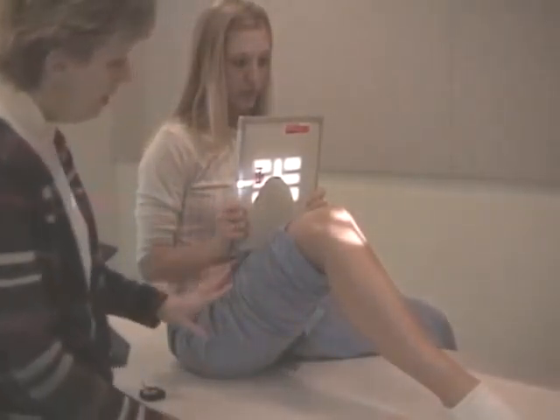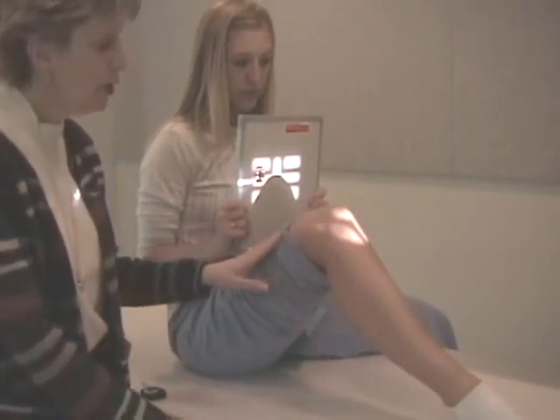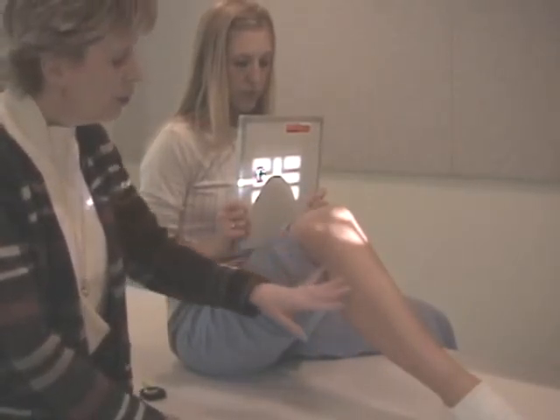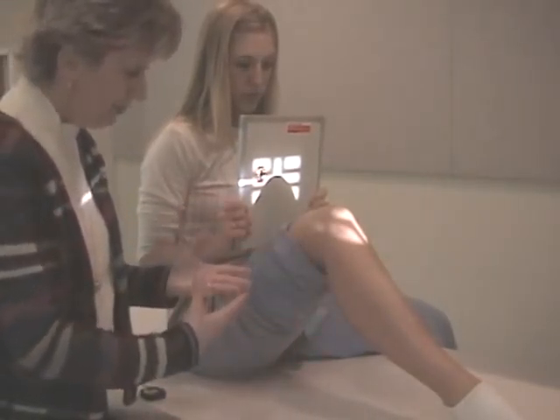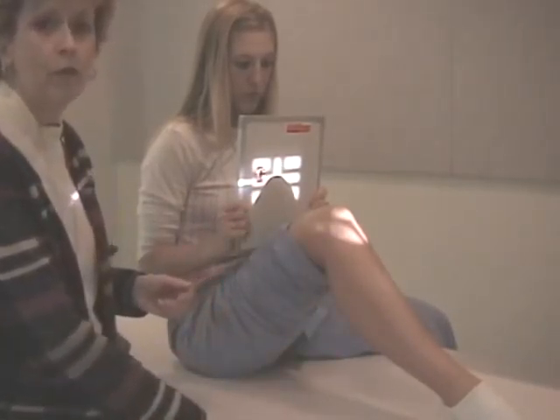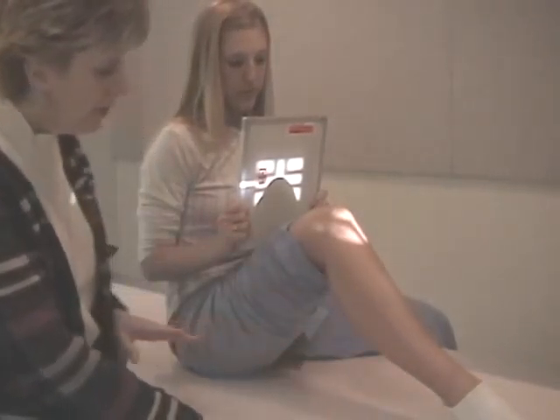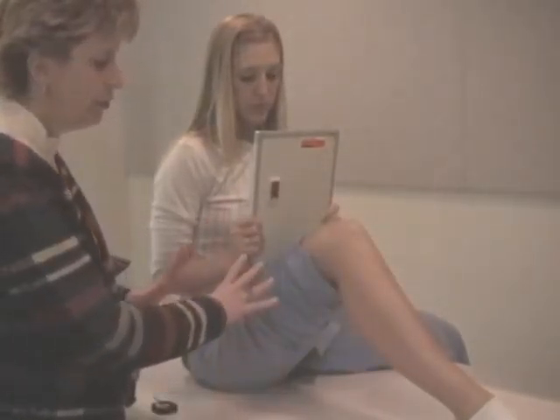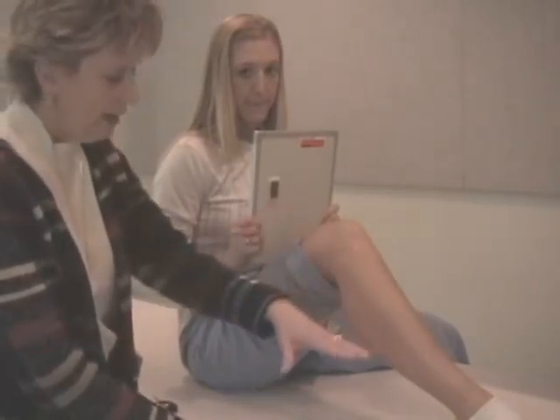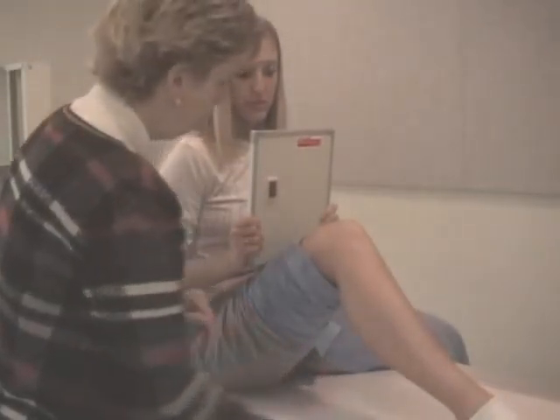Okay. And now what we've got going here is we have the patient's leg bent. The degree that the patient can bend their leg, of course, will depend on their pain tolerance. You don't need a lot of bending of the knee, but again, the patient will basically set themselves up in a comfortable mode, and then you move your equipment to their needs. I've got her set up on the low end of the table because many times it's a difficult time getting the tube low enough. So make sure your patient starts at an end of the table so your tube has flexibility to go lower and clear the tabletop.